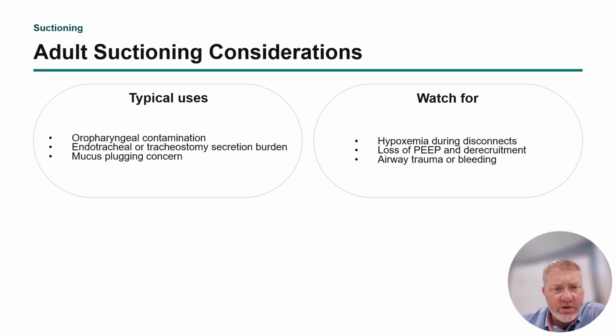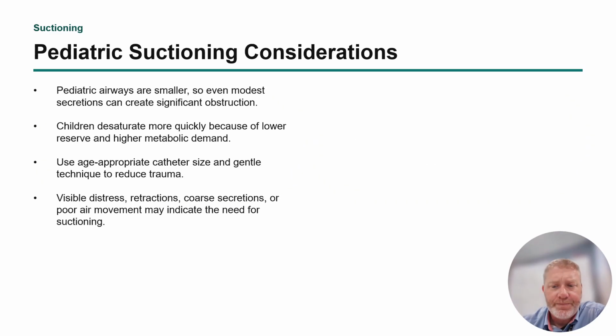When you do suction, always be aware for certain things: contamination. Watch for mucus plugging. Watch for desats. Watch for loss of PEEP, especially in patients who are on non-invasive ventilation, and airway trauma, bleeding, etc.